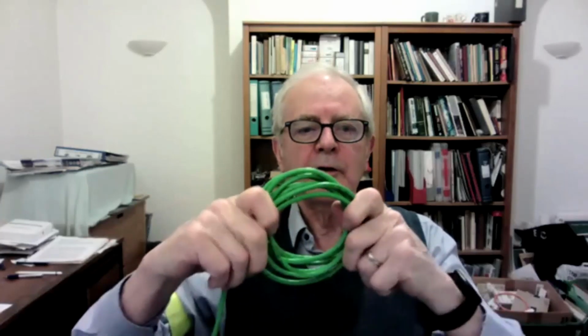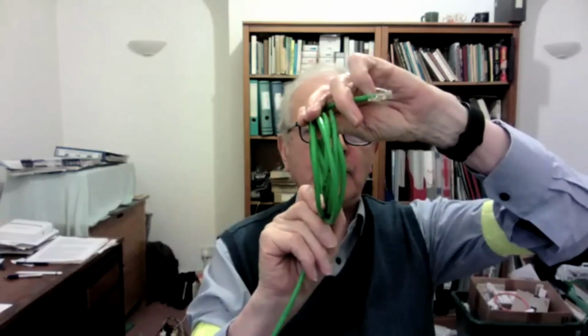I pass the current through, the magnetic field goes in and out of the coil. And it's got direction, so here it's going in and out of my screen, there it's going up and down, there it's going side to side. So by orienting the coils, I can change the direction of the magnetic field.